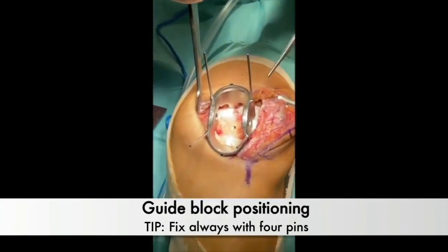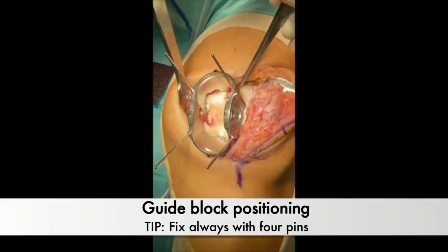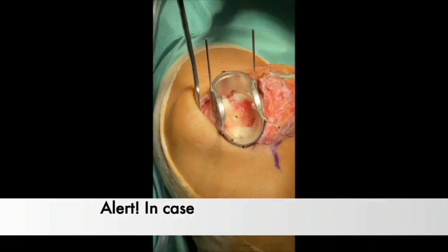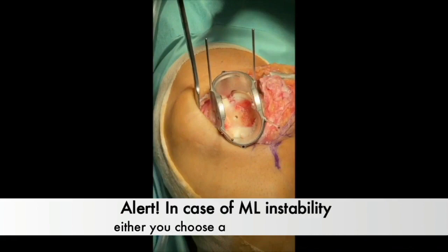Subsequently, the guide block is positioned within the reamed area and securely fixed with 4 pins. Careful manual handling prevents inadvertent ejection during pinning. In cases of AP instability of the block, you may choose a smaller radius block with a higher numerical value. Similarly, for instances of ML instability, it is advisable to initially opt for a larger radius block.